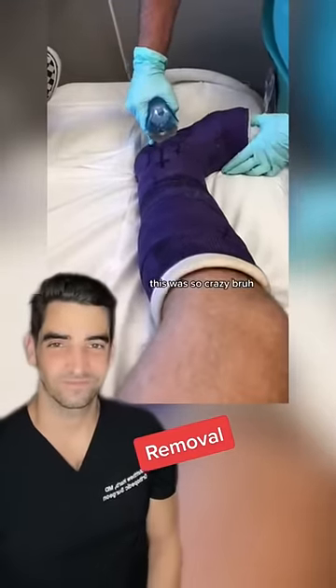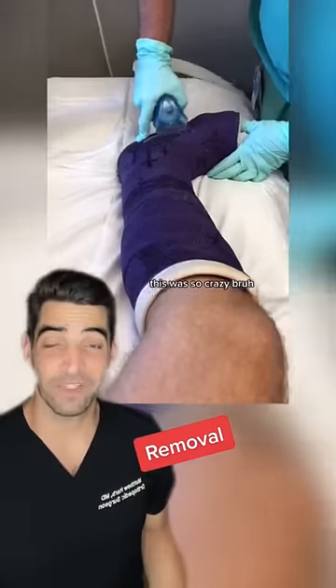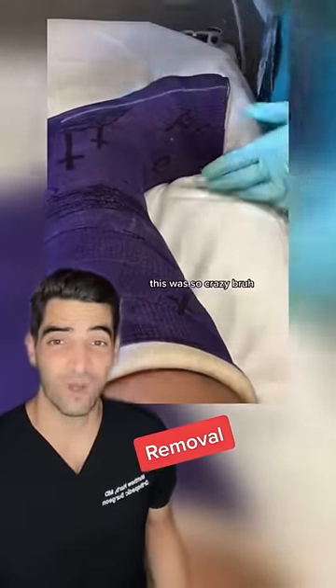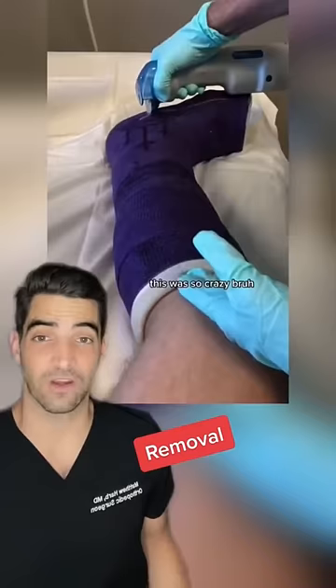This was so crazy. Have you ever had this happen to you? So he's taking this cast off. Let's talk about what exactly goes into taking a cast off.